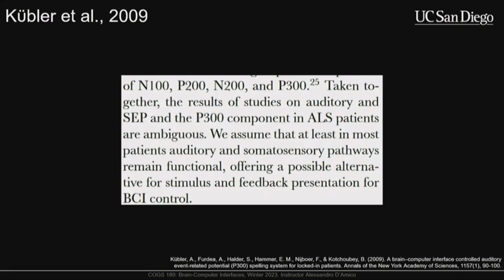So this is the other paper that was mentioned in that table. So in this case, what did I want from this? We assume that at least in most patients, auditory and somatosensory pathways remain functional, offering a possible alternative for stimulus and feedback presentation for BCI control. So building off that same logic of, okay, a lot of ALS patients and people in similar conditions lose the ability to process visual stimuli because they lose control of their eyes, and so on. So let's try to build an auditory-based BCI.